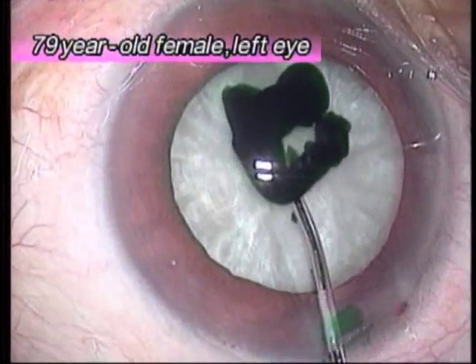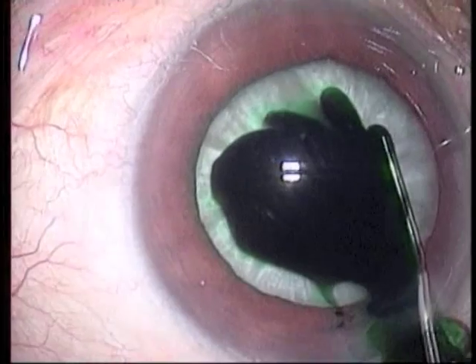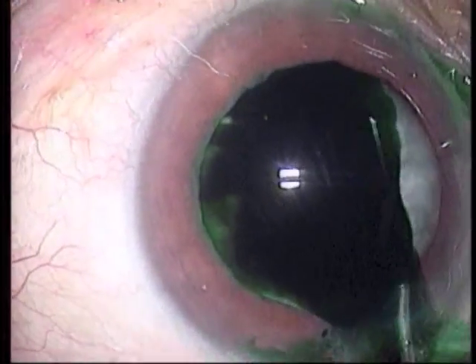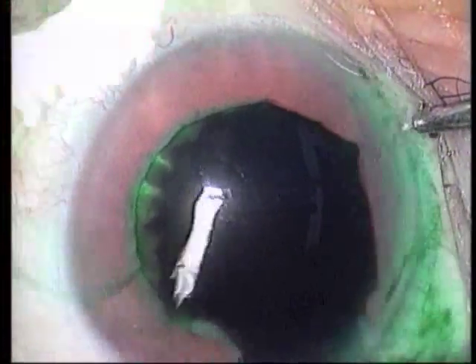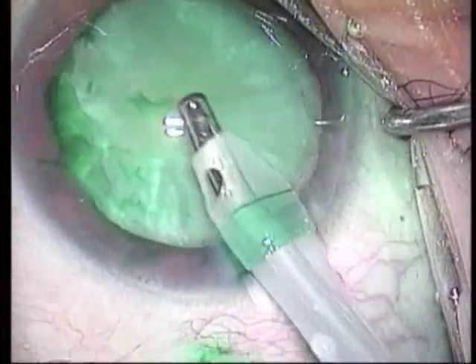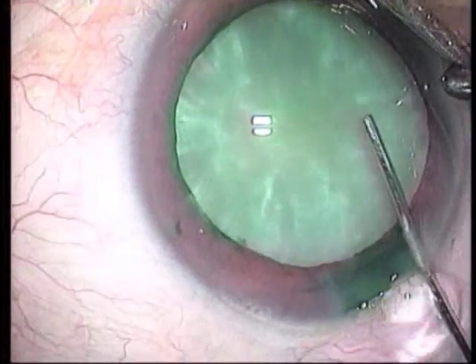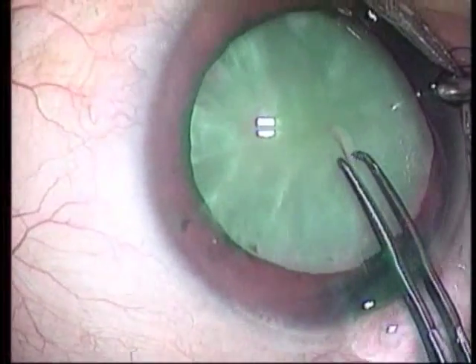This is the left eye of a 79-year-old female. Visco-ICG is painted on the surface of the anterior capsule after the soft-shell technique is performed. The corneal endothelium is protected from the ICG by extended viscoate. The viscoate ICG is removed via IA, and the anterior chamber is filled with viscoelastic material again. The CCC is started from the center of the anterior capsule using Inamura's forceps.